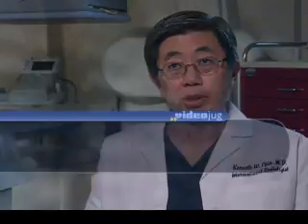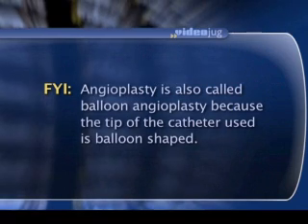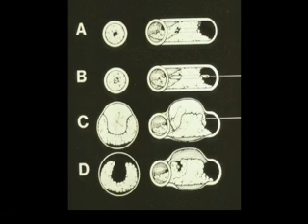They involve, for balloon angioplasty, placement of a special kind of thin plastic tubing, a catheter, onto which is mounted a special kind of balloon. These balloons are graded to open up only to a given diameter. That results in safety, so that the balloon doesn't overexpand a blood vessel, causing it to potentially rupture. By opening up the blood vessel, we can then stretch it and actually partially tear it in a controlled fashion so that it stays open.